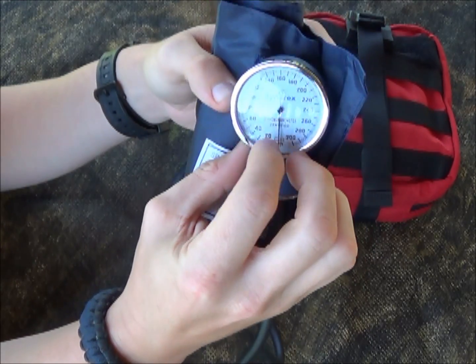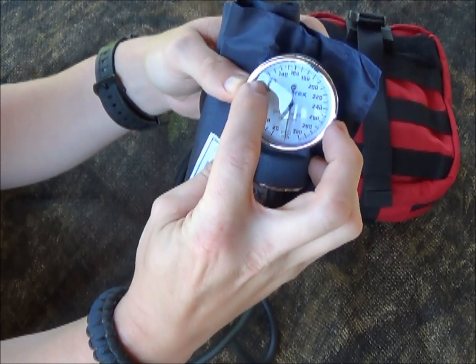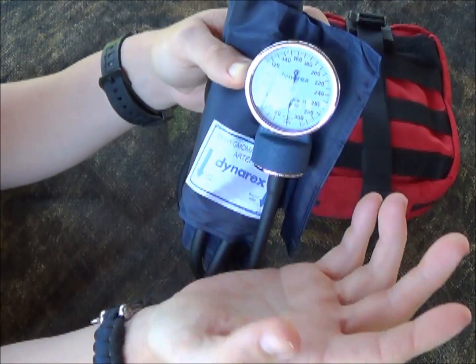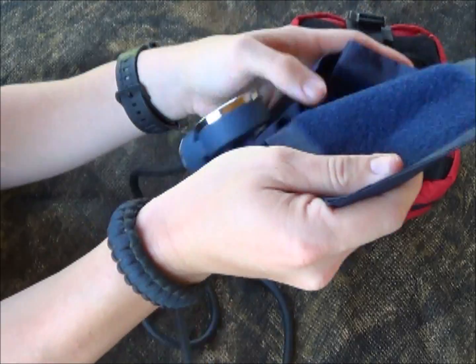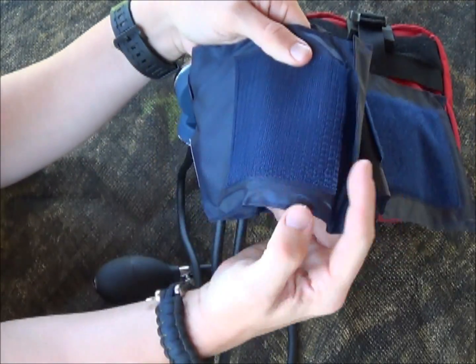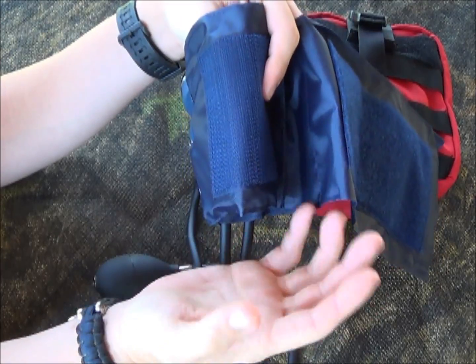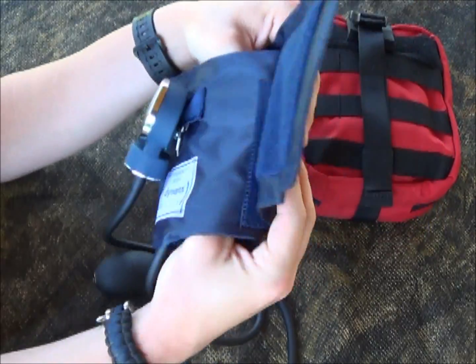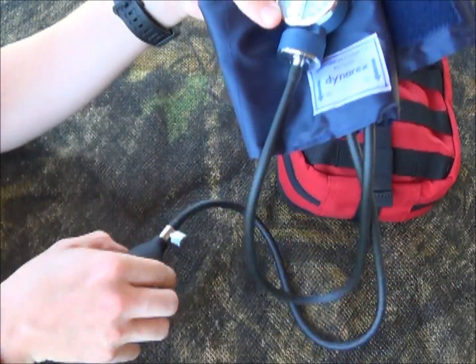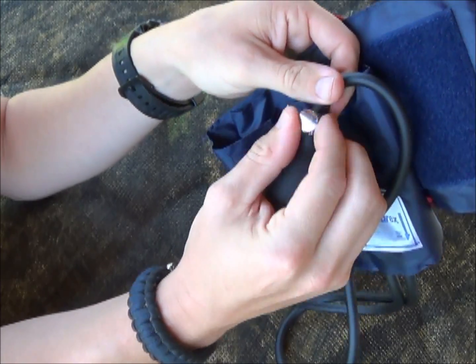You can see it has a gauge here — this is going to tell us what our systolic blood pressure is, the top number, when we go to palpate. It has Velcro, and it goes around the patient's upper arm where the bicep is, just above the elbow. Put the Velcro on and tighten it down — righty tighty, lefty loosey.